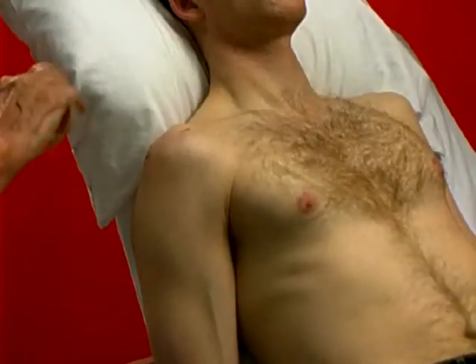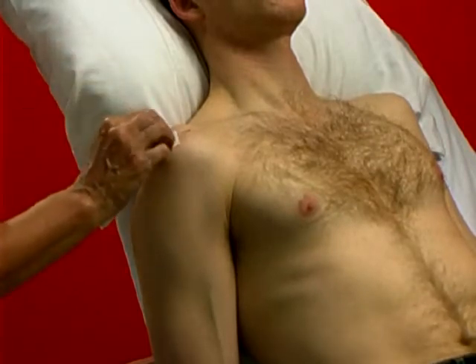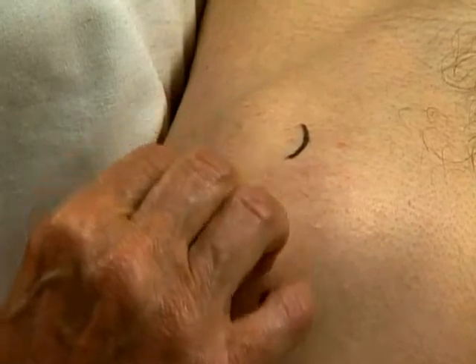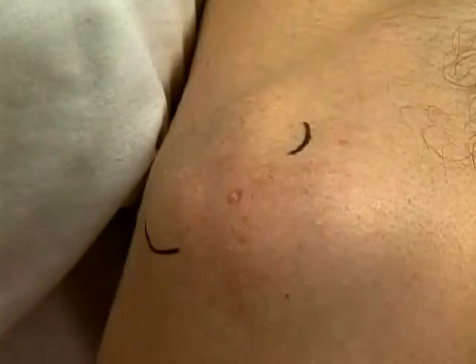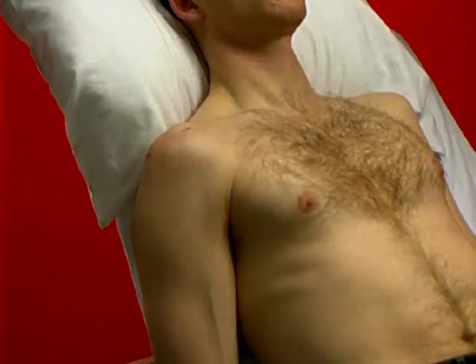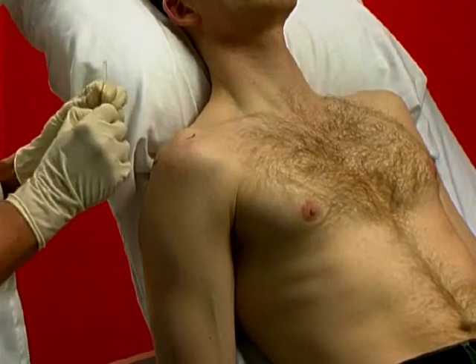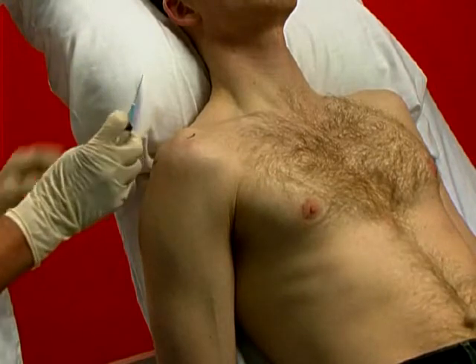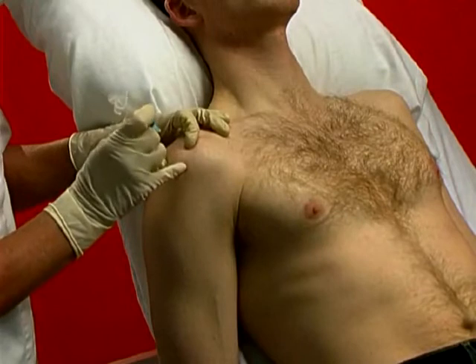Clean the skin using a spiraling action and then thoroughly wash the hands. Gloves may be worn but are not mandatory in Britain. Draw up 30 to 40 milligrams of corticosteroid, mixed with 4 ml of 1% local anaesthetic.